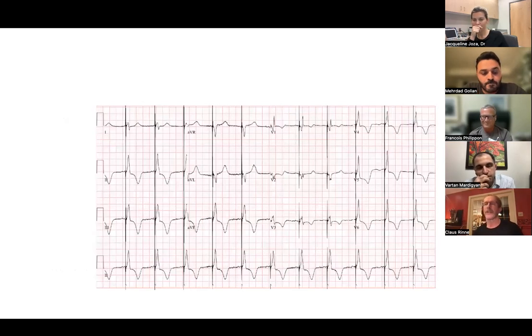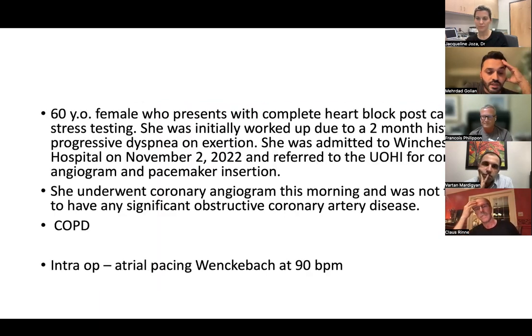Yeah. It'd be interesting to do them all again a week later. I think the ones with very abnormal, you'll see them a lot, at least with the left bundle ones and the ones that are pacing dependent. I find that have been paced for quite some time. Some, but I don't know, T-wave memory issue, yeah. I always like throwing out those terms. Nobody ever knows what T-wave memory is, at least I've never been able to understand what it is, but certainly it seems to be real. Yeah.